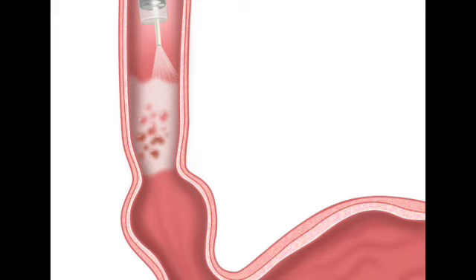How so? Well, in the stomach, the acetic acid spray is used to define the extent of something called gastric intestinal metaplasia. Gastric intestinal metaplasia. Okay, let's break that down for everyone. Sure. It is a condition where the cells lining the stomach actually change to resemble the cells that line the intestines. Oh, weird. Yeah, it's an abnormal change, and it's often a precursor to cancer.